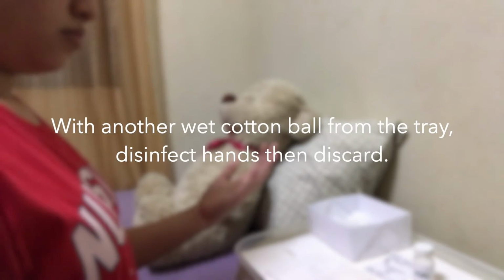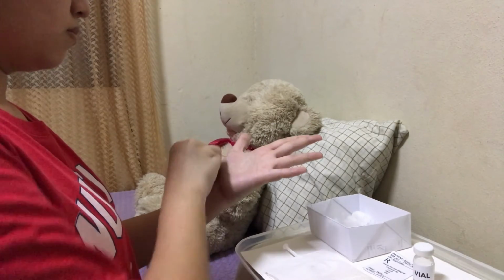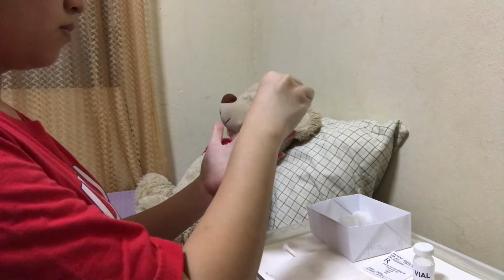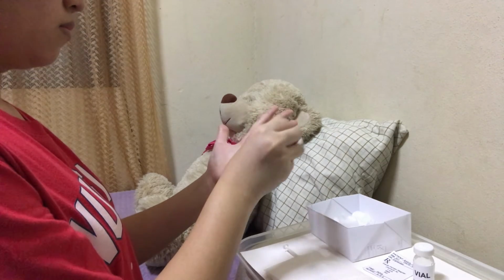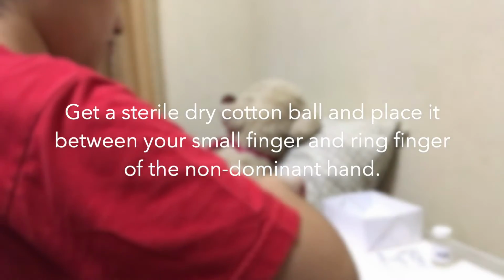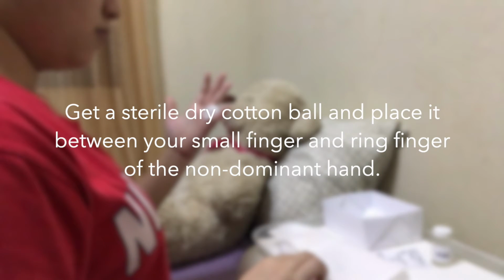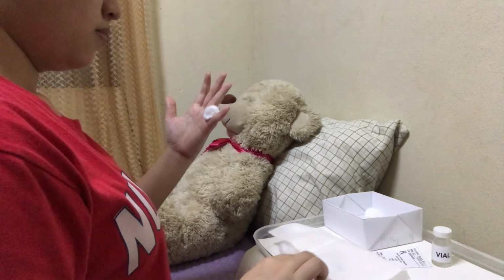With another wet cotton ball from the tray, disinfect your hands, then discard. This is to prevent cross-contamination and adhere to the principle of microbiology. Next is to get a sterile dry cotton ball and place it between your small finger and ring finger of the non-dominant hand. This will be used in applying pressure after the administration.